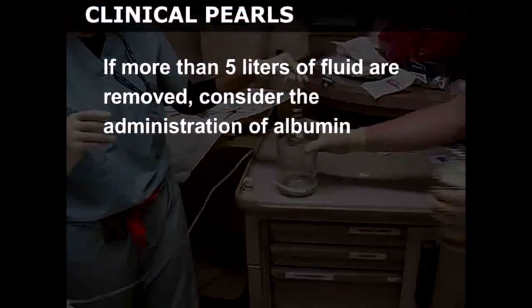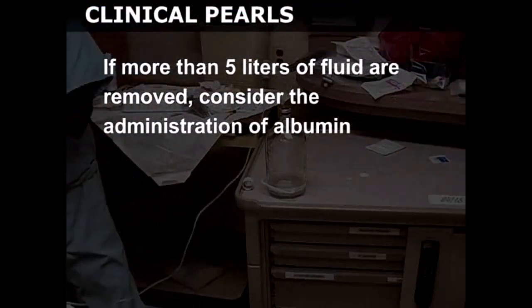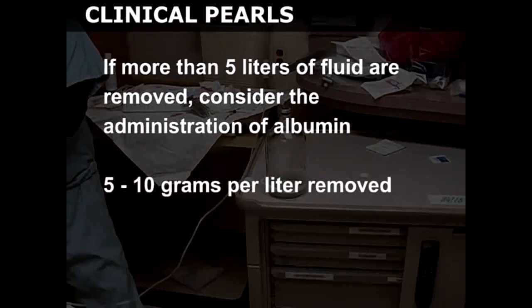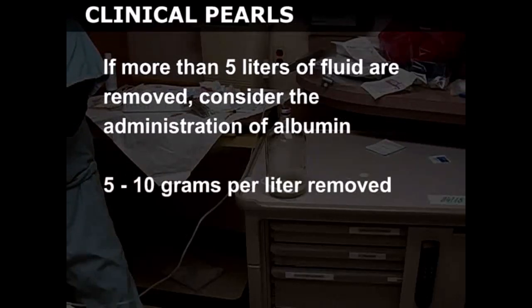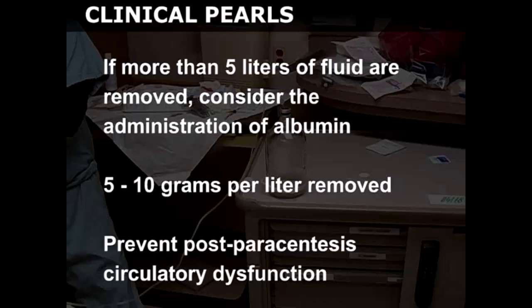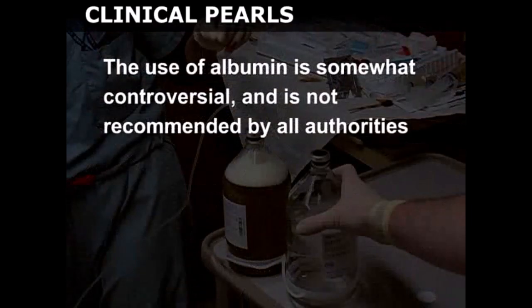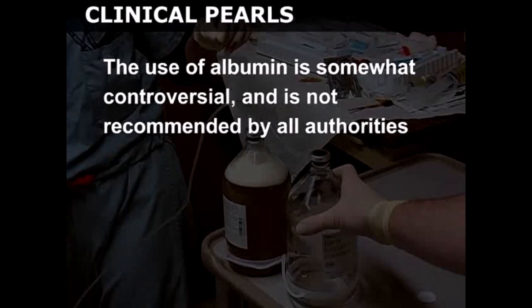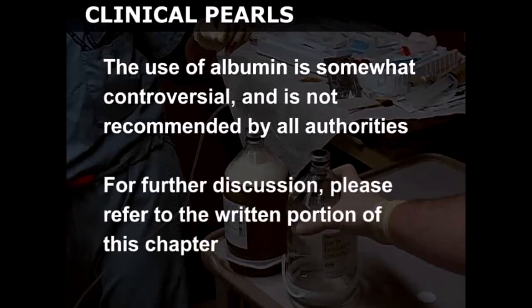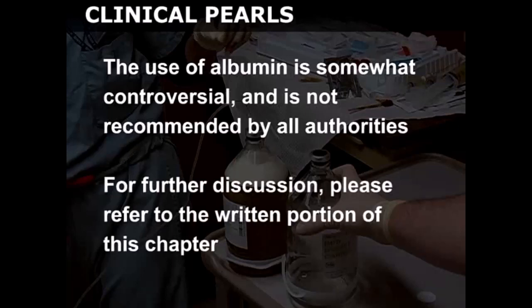In situations where more than 5 liters of ascitic fluid are removed, you should consider the administration of albumin at a dose of 5 to 10 grams per liter of fluid removed, in order to prevent post-paracentesis circulatory dysfunction. The use of albumin is somewhat controversial and is not recommended by all authorities. For further discussion of this issue, please refer to the written portion of this chapter.